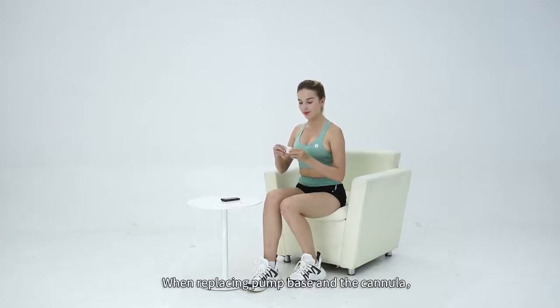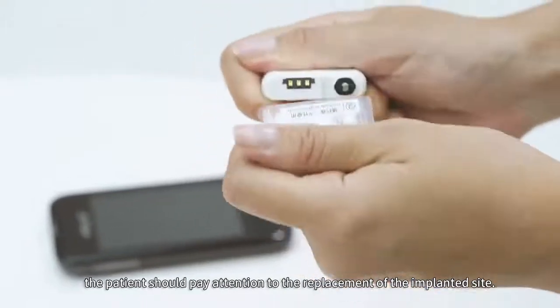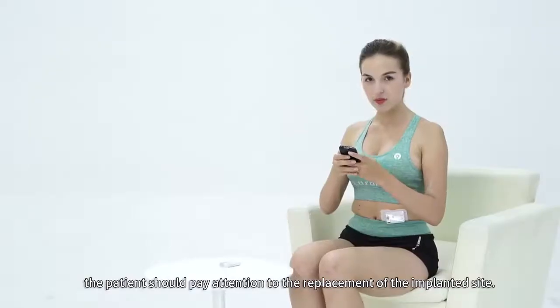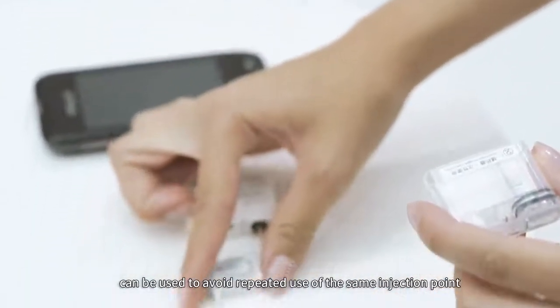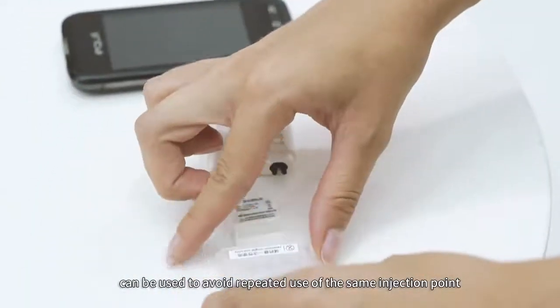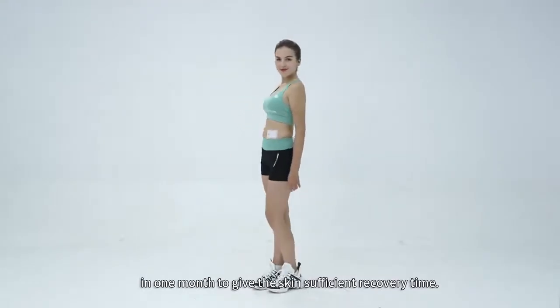When replacing the pump base and the cannula, the patient should pay attention to the replacement of the implanted site. The large rotation and small rotation can be used to avoid repeated use of the same injection point in 1 month to give the skin sufficient recovery time.